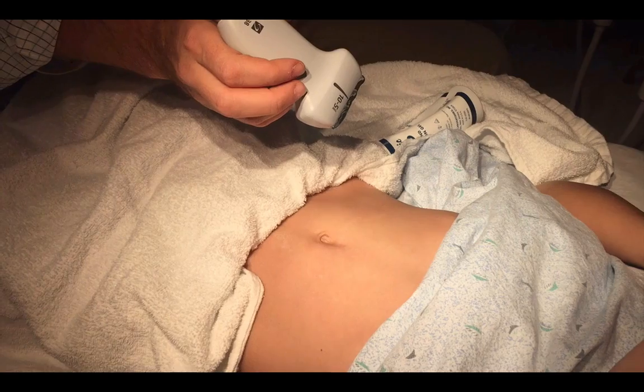Hey, before you go all Rambo and start pushing on that right lower quadrant that's already hurting in your patient, please be nice to them. Use some warm gel and give them some pain control with some IV morphine or some intranasal fentanyl. Okay, back to the scan.